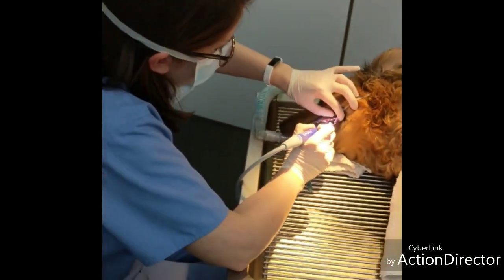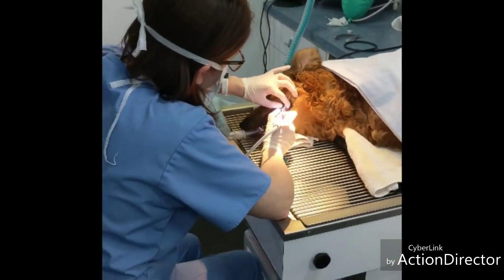She has a little IV catheter right here in that leg. Here we are, somewhere under those golden retriever feathers. Keeping her nice and warm. That's very important with anesthesia. And soon, she'll be all done.